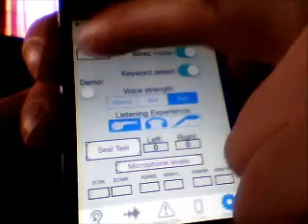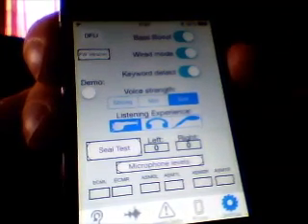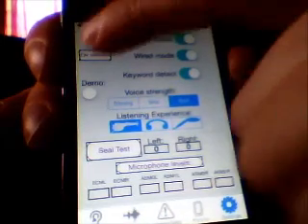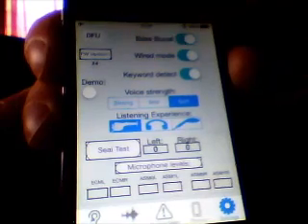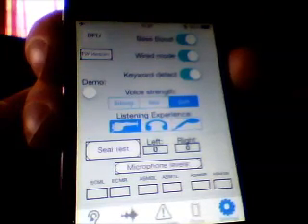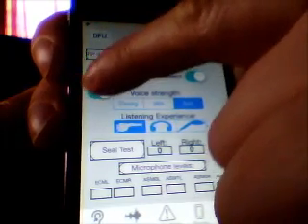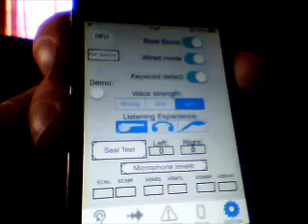Pressing this firmware version button sends a BTLE command to the hardware and it displays the firmware version. As you can see, it displayed the number 24, and that number disappears after a number of seconds. The demo switch sends a BTLE command to enter the earphone into a demo mode.